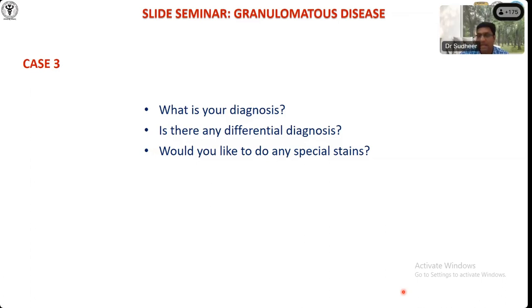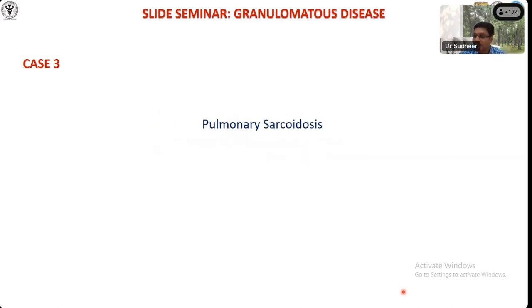So identifying granuloma is not the only thing. The distribution of granuloma, where they are located, is very important, and gives typical clues along with the history. I mentioned this patient had a skin lesion and recurring eye inflammation, and on lung biopsy you have discrete multiple non-necrotizing, lymphocyte-poor granulomas with peripheral lamellated fibrosis. After discussion with the ophthalmologist, the dermatologist and the pulmonologist, you can come to a conclusion that it is a case of sarcoidosis. So I am highlighting the multidisciplinary approach.